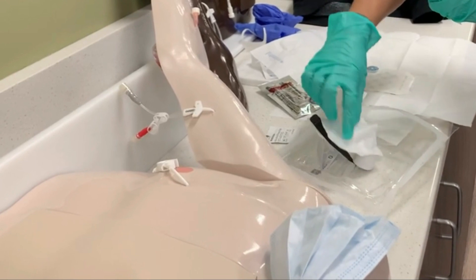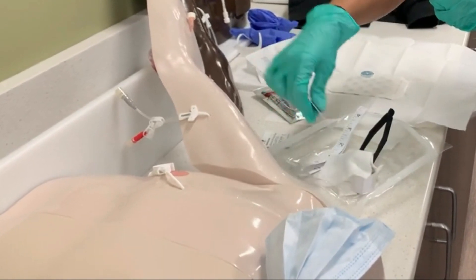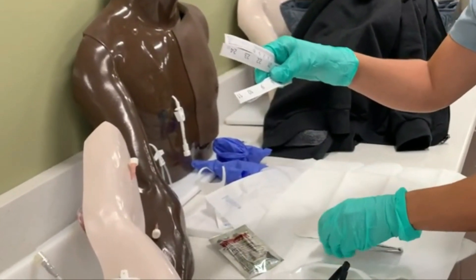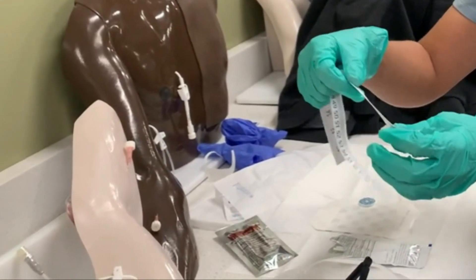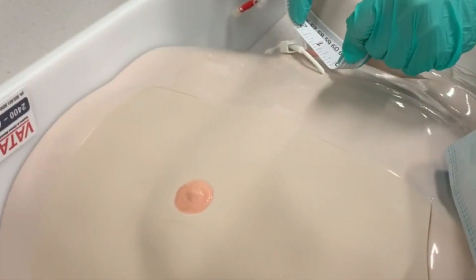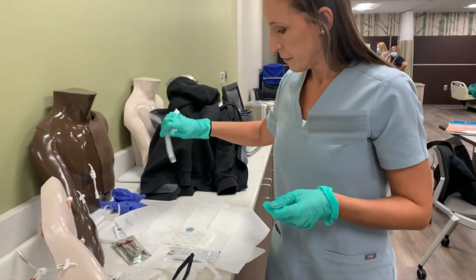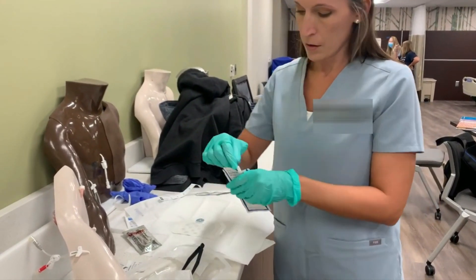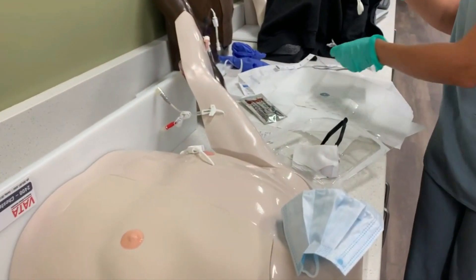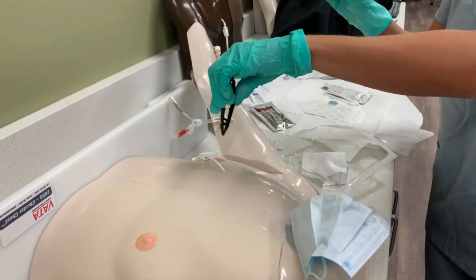You also have gauze, tape, and tweezers — this kit is really nice because it does have tweezers. The measuring tape is to measure how far out the central line is from the body, but don't get your gloves contaminated doing this. That way if the line moves, you'll know exactly how far out it was. So take your swabs — since I already have them here, I'll take them out of my package; they're still sterile, sterile to sterile. The tweezers are nice for holding up the catheter.